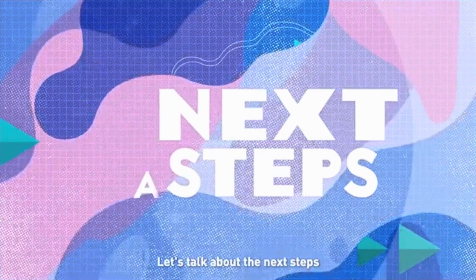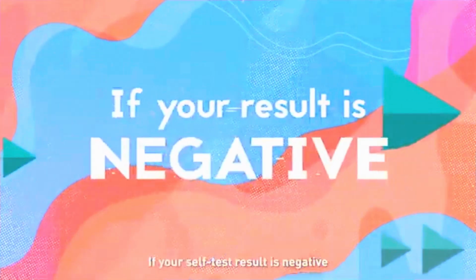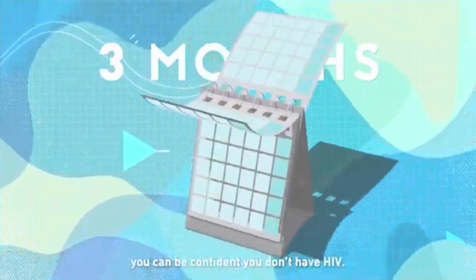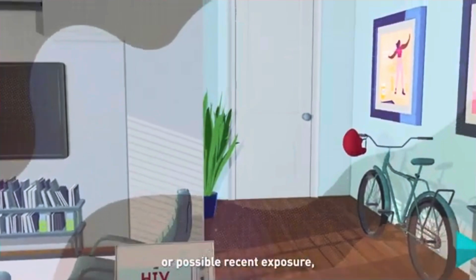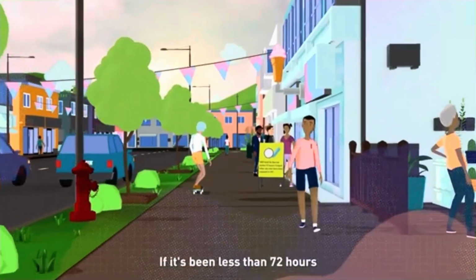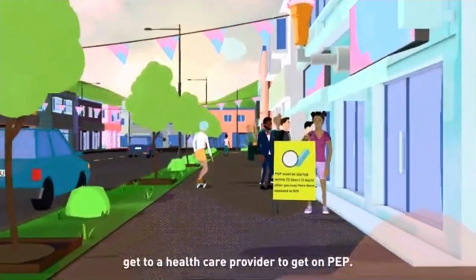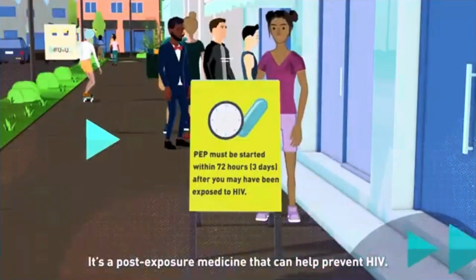Let's talk about the next steps and how to understand your self-test results. If your self-test result is negative and you haven't had a possible exposure during the previous 3 months, you can be confident you don't have HIV. If you're unsure about your self-test result or possible recent exposure, visit a healthcare provider to get tested again. If it's been less than 72 hours since you think you were exposed to HIV, get to a healthcare provider to get on PEP. It's a post-exposure medicine that can help prevent HIV.